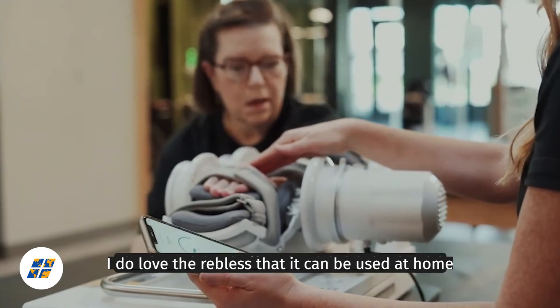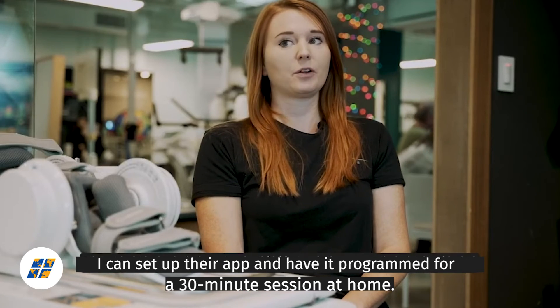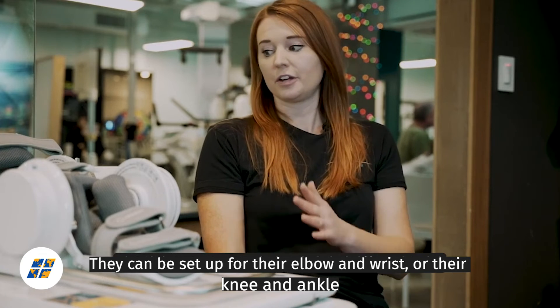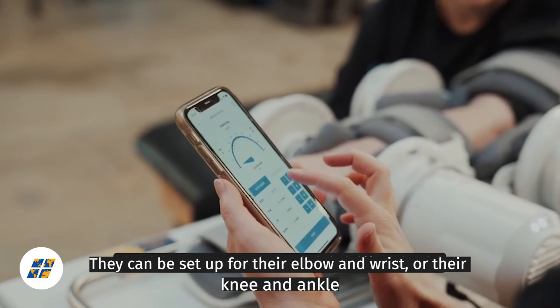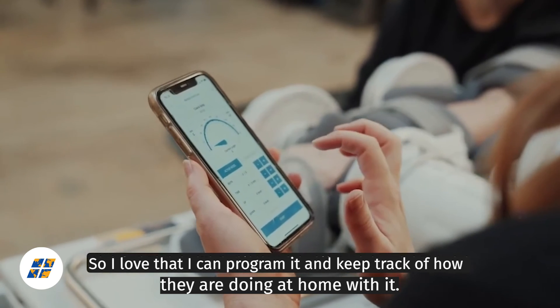I do love that the Rebless can be used at home. I can set up their app and have it programmed for a 30-minute session at home. They can be set up for their elbow and wrist or their knee and ankle, so I love that I can program it and keep track of how they're doing at home with it.